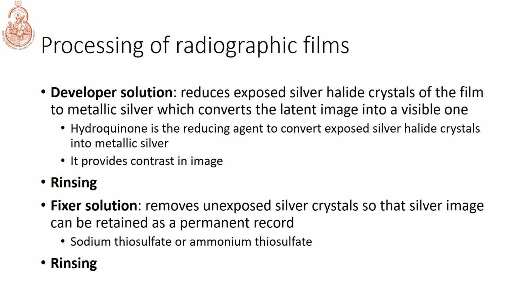And if we are unlucky enough, if those bubbles attach onto the area where the actual lesion was, I am going to miss that lesion and I am going to have a bad diagnosis. So make sure that this is not being done.